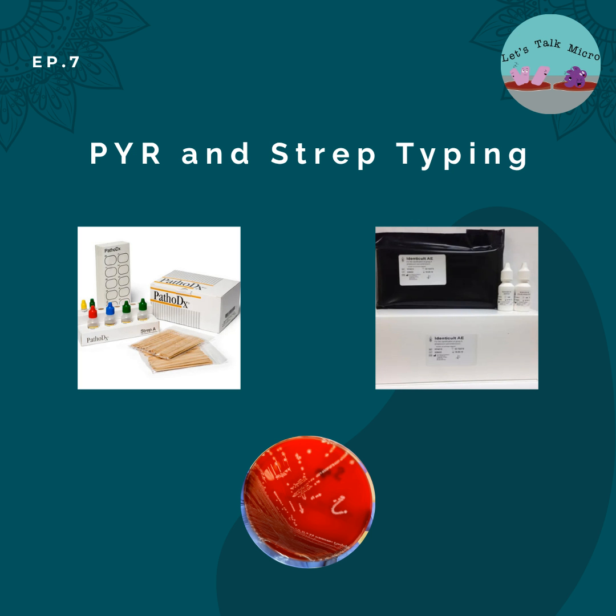Then B also has a very distinctive morphology. So a lot of times, when you have a PYR negative result, you can just go ahead and check if it doesn't look like B, which is not as hemolytic as C, F, and G. The colonies are milky white. So if it doesn't look like that, then go ahead and test for C, F, and G. I mean, if they're negative, go ahead and test for B as well. So at least the PYR points you in the right direction.